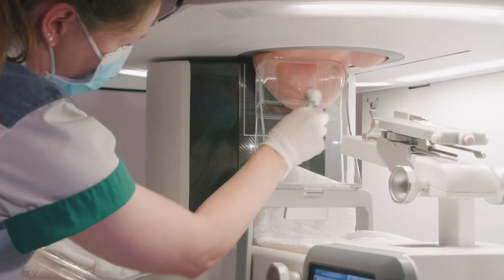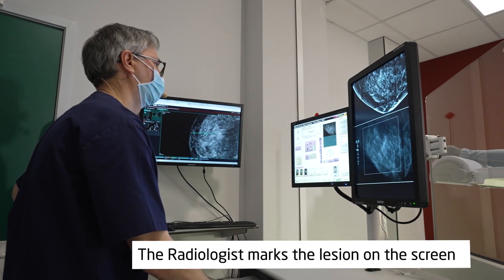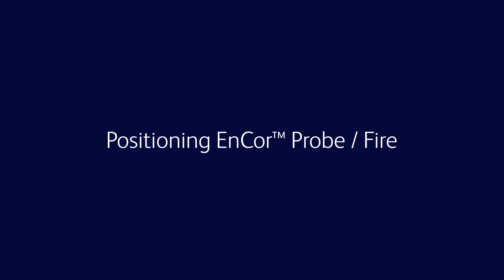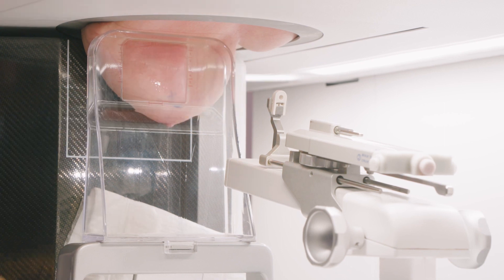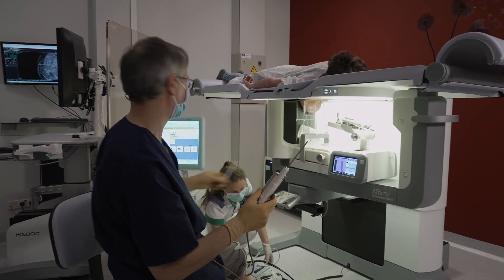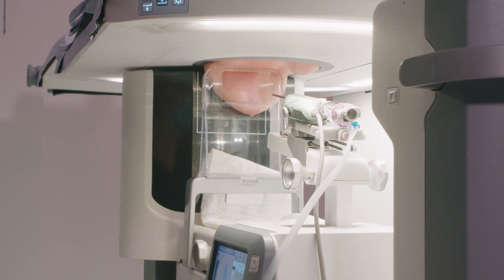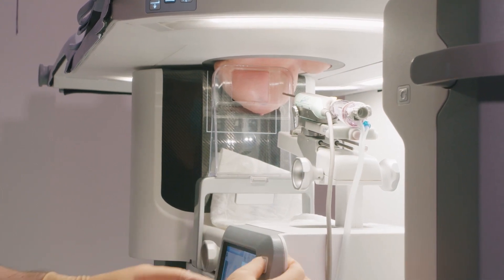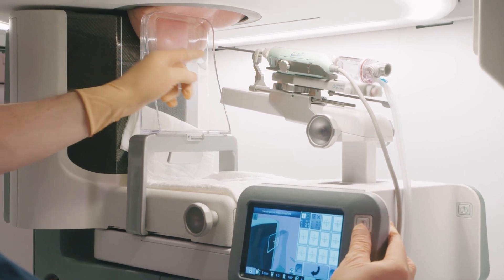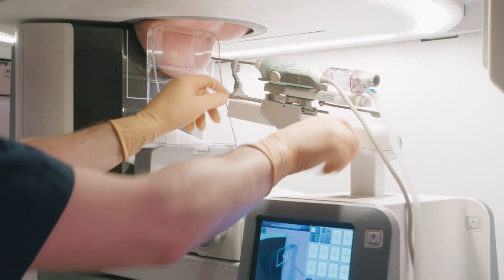The nurse disinfects the skin with an alcohol solution. I place a sterile needle guide on the holder of the biopsy table. After calibration, I place the needle on the holder and fix it. On the basis of the measured coordinates, we automatically guide the needle to the correct X and Y position. The Z position in depth has to be positioned manually. We place the needle in front of the skin.